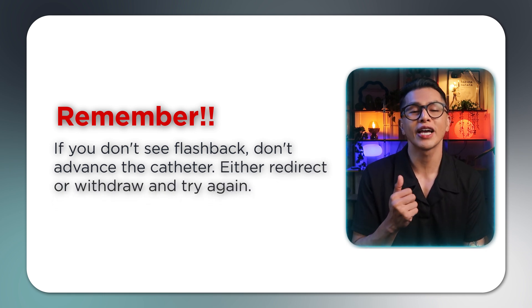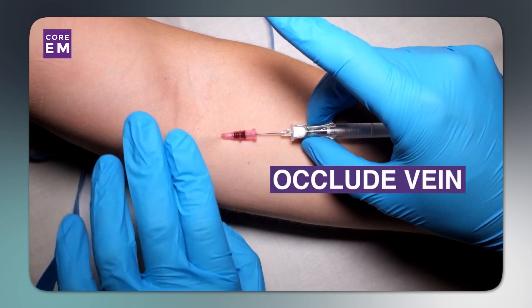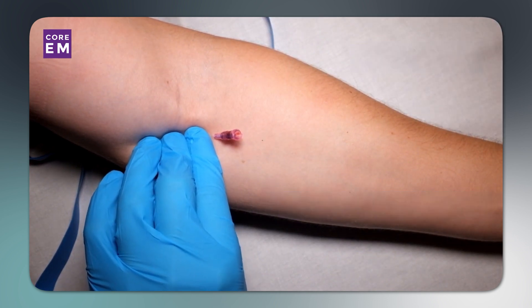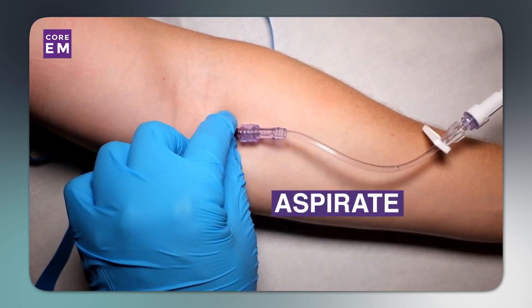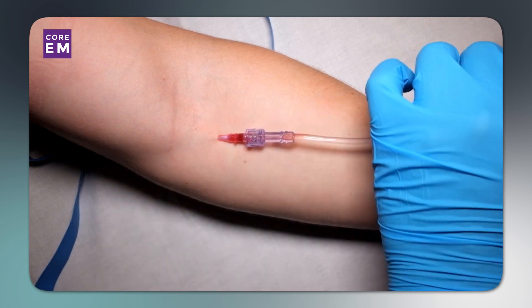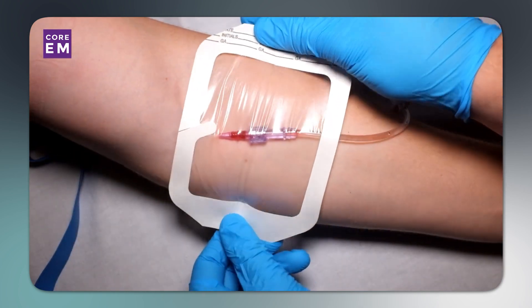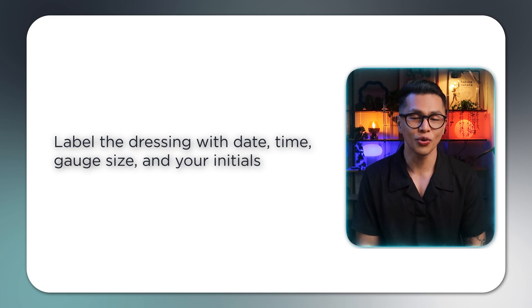Step 4: Secure the IV. Proper securing prevents dislodgement and complications. Release the tourniquet. Apply pressure over the vein just above the catheter tip to prevent blood backflow. Remove the needle completely and immediately dispose of it in the sharps container. Connect the needleless connector or attach a saline flush directly. Flush the cannula with saline using a pulsatile push-pause technique. Observe for signs of infiltration such as swelling, pain, and resistance. Apply the transparent dressing over the insertion site and secure with tape using a chevron technique. Label the dressing with date, time, gauge size, and your initials.